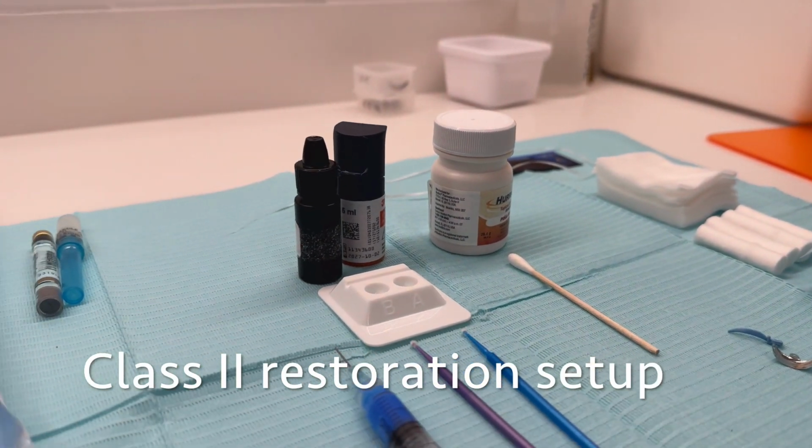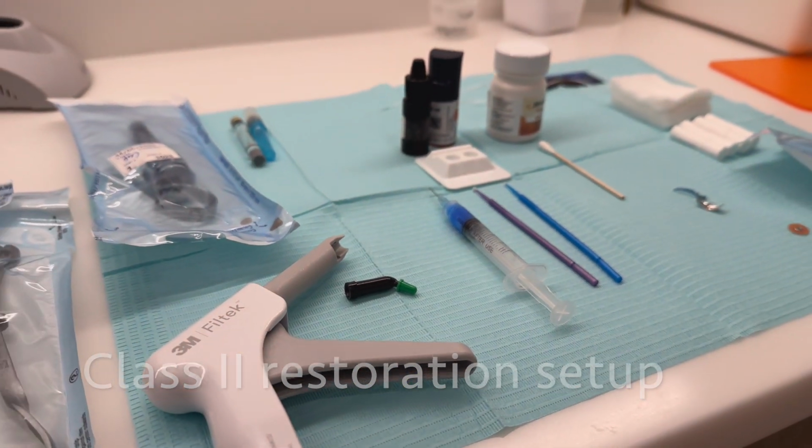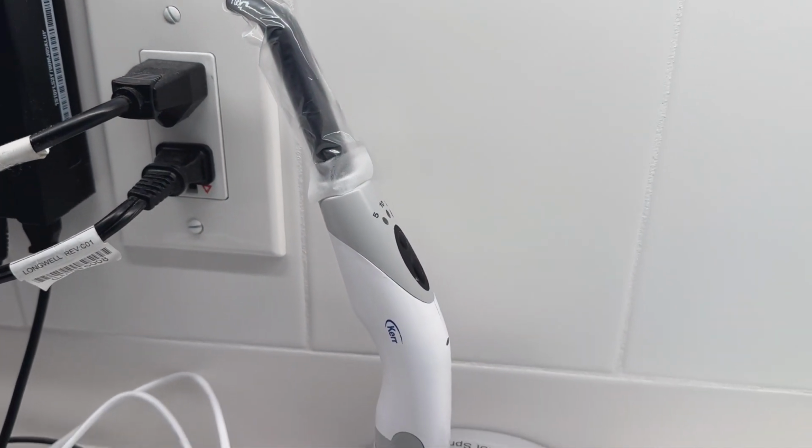Today we're going to be showing you how to set up for a Class 2 restoration. This Class 2 means that there is an occlusal surface as well as one proximal surface in the restoration.